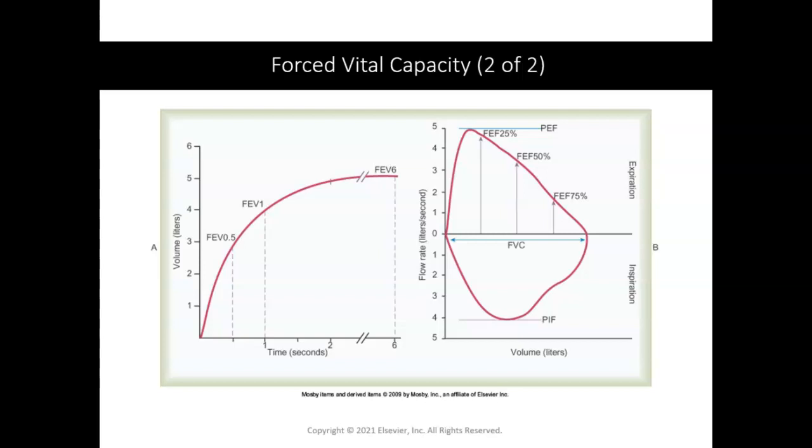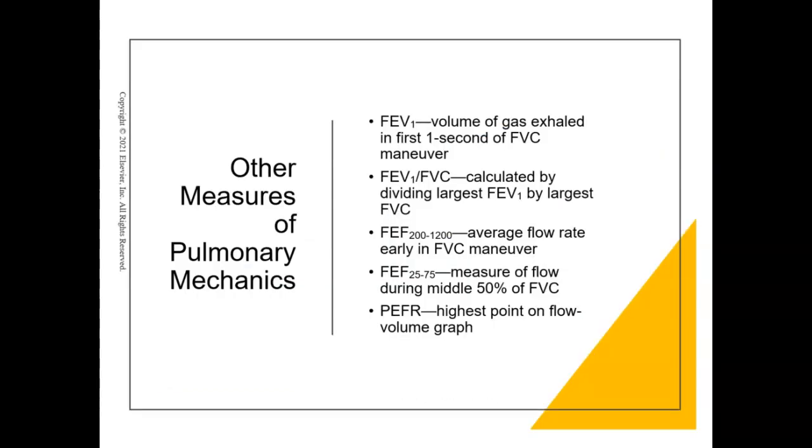So typically when we do forced vital capacities, we're trying to do this for baseline testing. So typically we tell our patients to not take their bronchodilators. So don't take their short-acting bronchodilators like albuterol or Atrovent. Typically we want to hold those for about 4 hours from the time of testing.